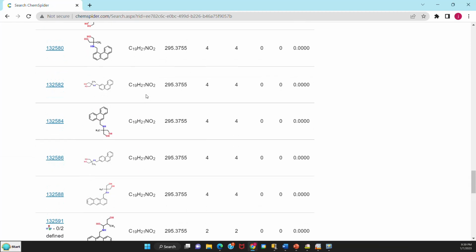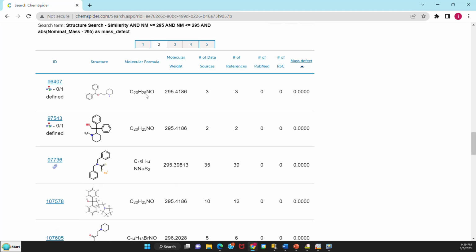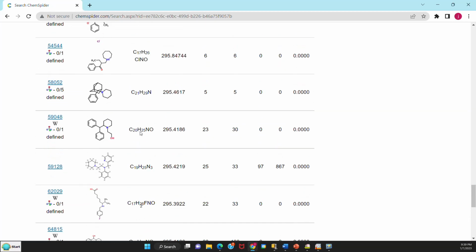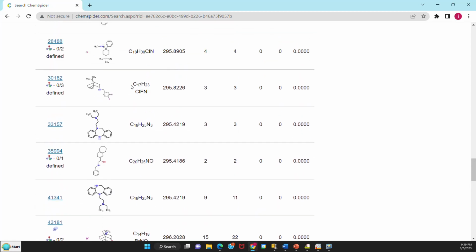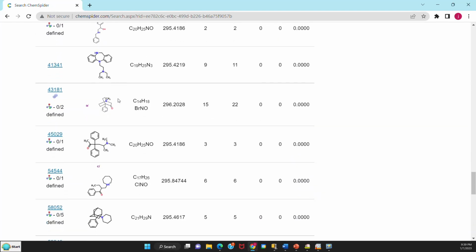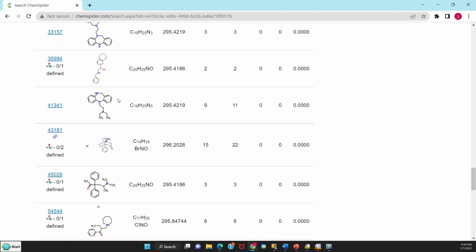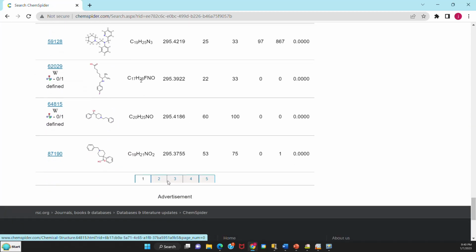in the first page. All of them don't have something branching out of the center methylene group. So we'll go to page, that was actually sitting on page 1. Here's page 1. Might have been on the wrong page. I was on page 2 for some reason. So if we scroll through page 1, we won't see anything. And there was our compound. Page 1. Sorry. There it is. So it is still in this list. And don't see any other candidates.